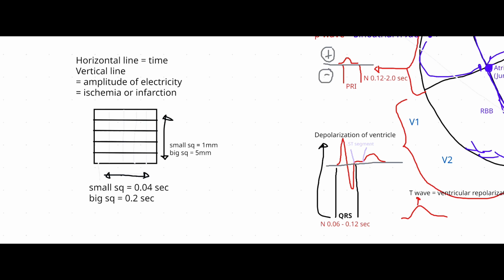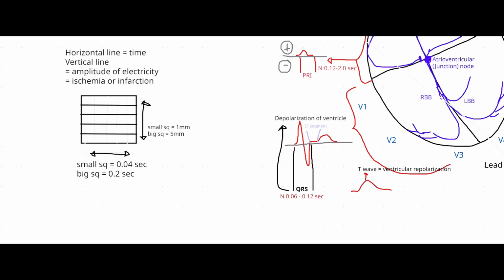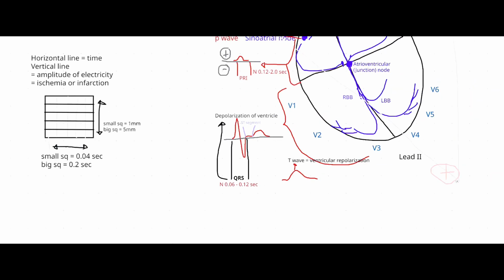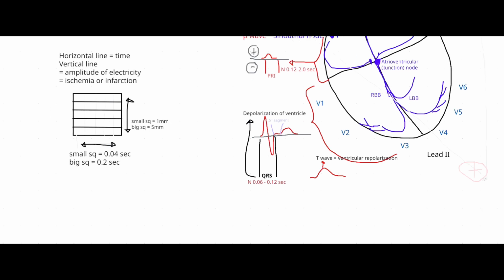Okay. I alluded to the Q wave. Let me add the Q wave because I mentioned to you that there's not always a Q wave, right? So I'll put a complete wave. So here's the P, Q, R, S, go back to baseline, ST segment, T. So here's the P, Q. So this Q here is significant.